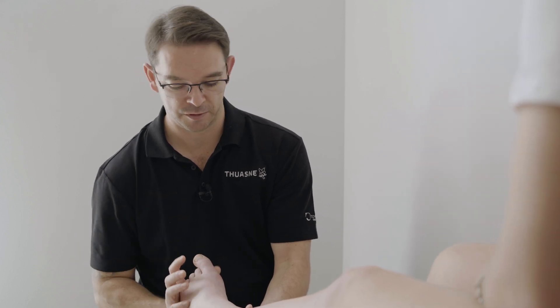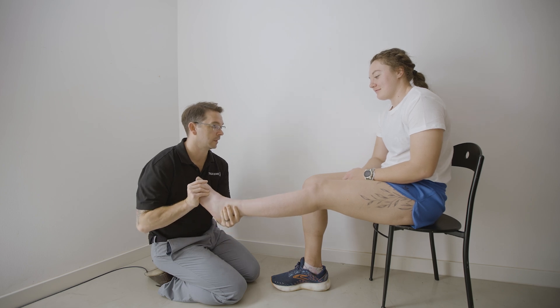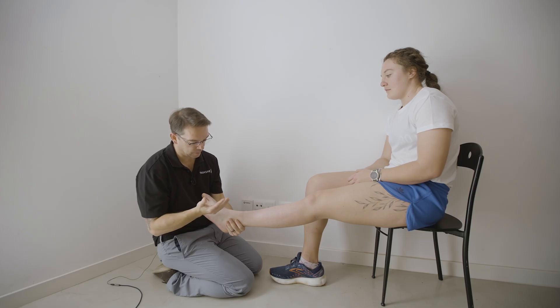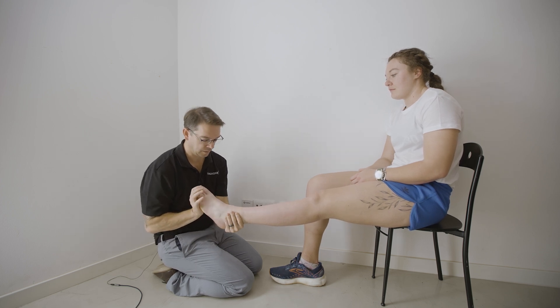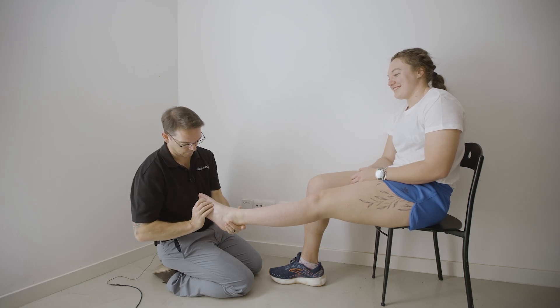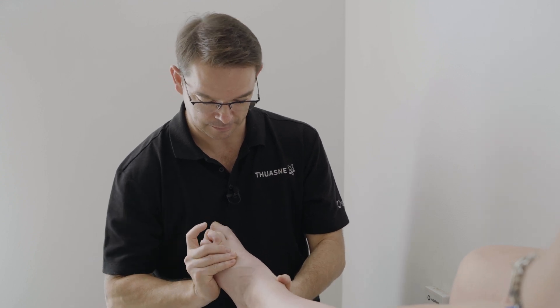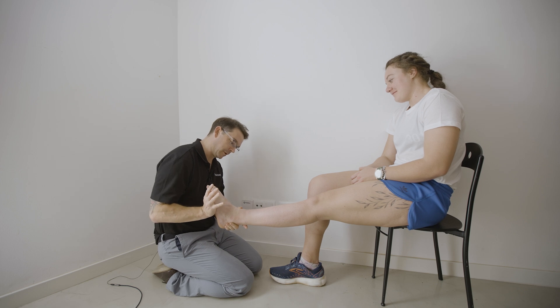I am now going to see how much range — or lack of range — there is in your foot. I can see we have some tone kicking in with your leg extended. The foot is adopting an equinus position where it is inverting and plantar flexed. I need to see if I can correct this with the knee extended, and I can see there are large amounts of tone. You have told me about a special trick which I am going to try — I have dorsiflexed the third toe and the foot has completely relaxed and is in a plantar grade position.